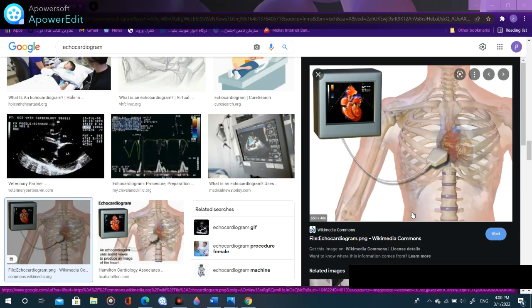In echocardiography, ultrasound waves hit the wall of the heart and can be seen visually in the device. Echocardiography includes 4 information processing systems. It makes the 2D view.